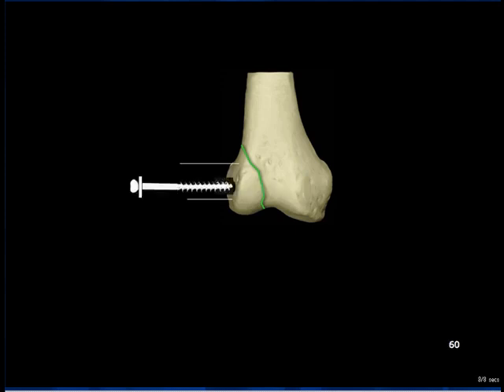The screw of chosen overall length and thread length is then inserted. If the cortex is anything other than strong, then a washer is used. If in doubt, use a washer. As the screw is driven home, the tip creates the thread in the bone by impacting it aside. There is no need to drill the cortex to 4.5 mm to accommodate the shaft. This will enter the bone with ease once the 6.5 mm thread has been created. As the screw is tightened, the fracture plane is compressed.